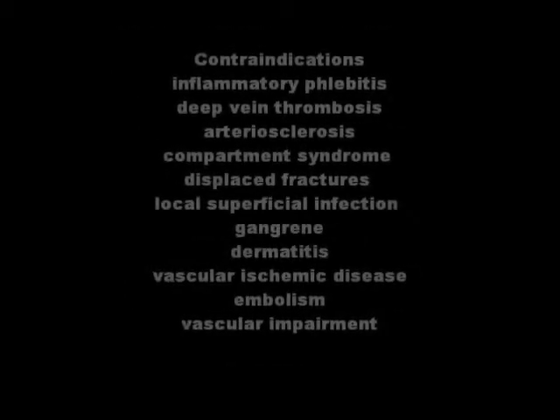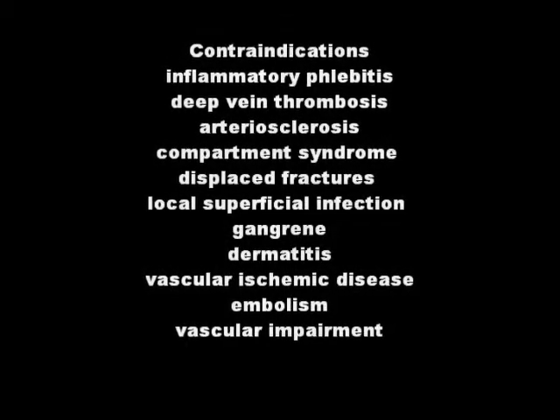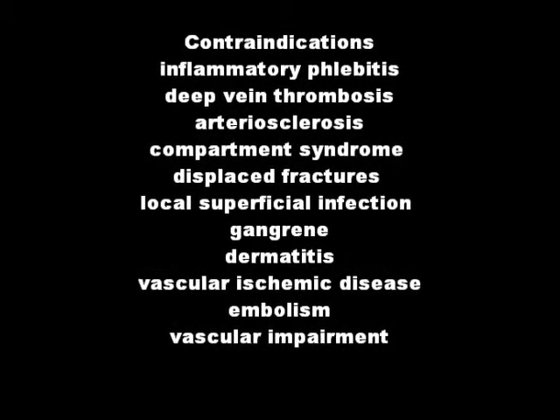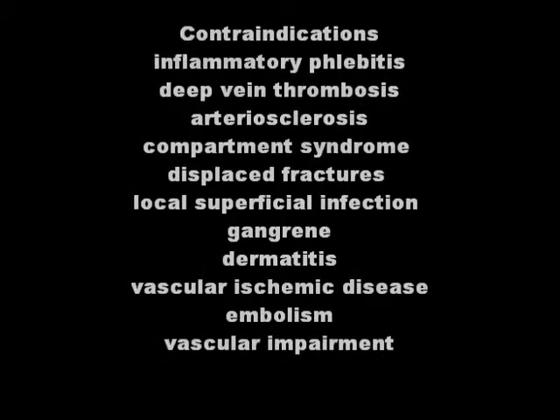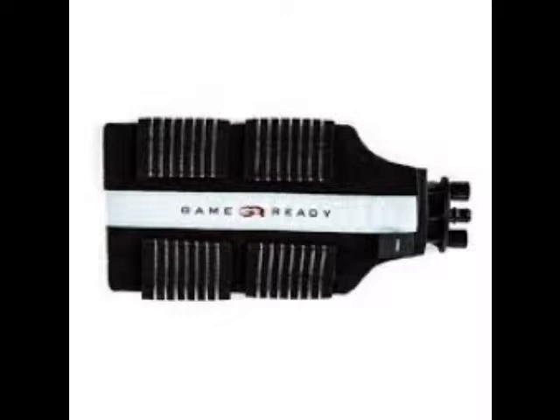The contraindications for the GameReady are acute stages of inflammatory phlebitis, deep vein thrombosis, arteriosclerosis, compartment syndrome, displaced fractures, local superficial infection, gangrene, dermatitis, vascular ischemic disease, embolism, and vascular impairment. The clinician should use caution if the patient is hypersensitive to cold and check on them constantly. The clinician should also use pain as a guideline during their treatment.